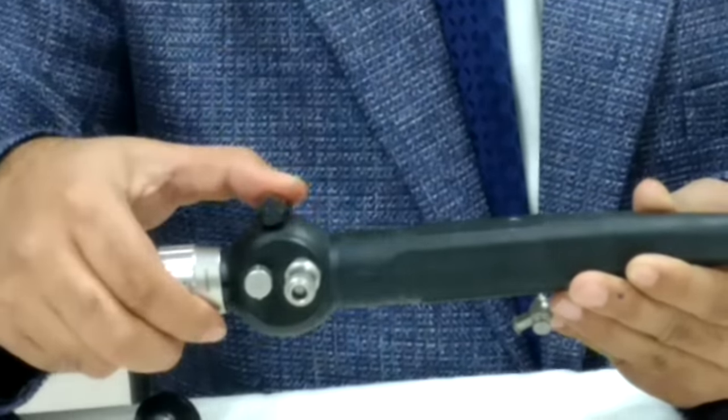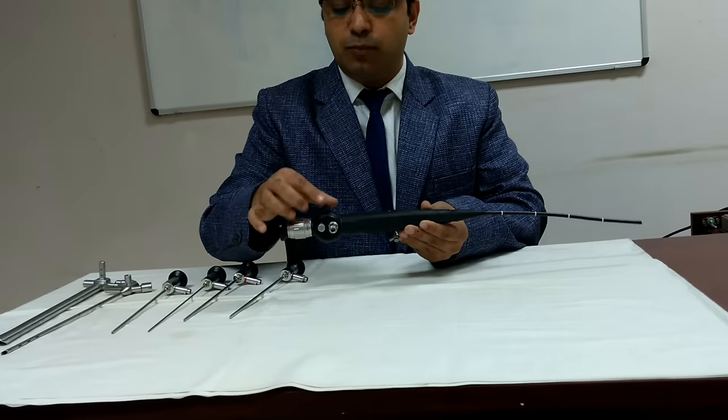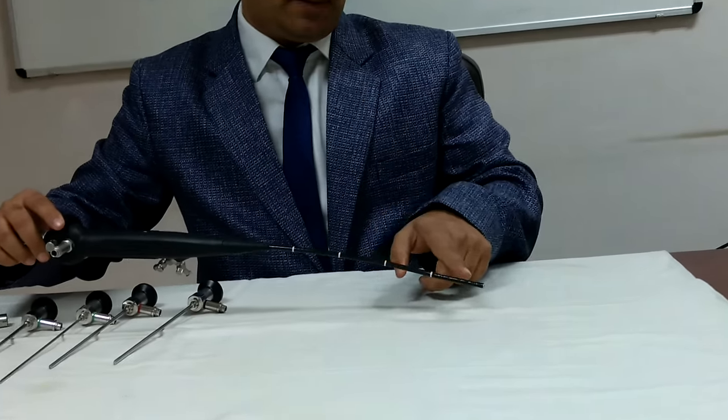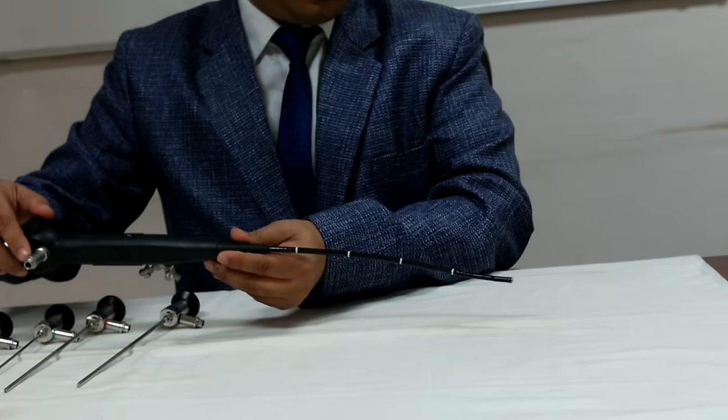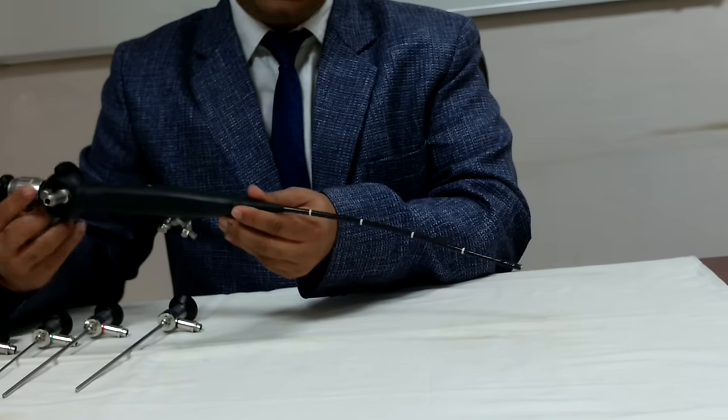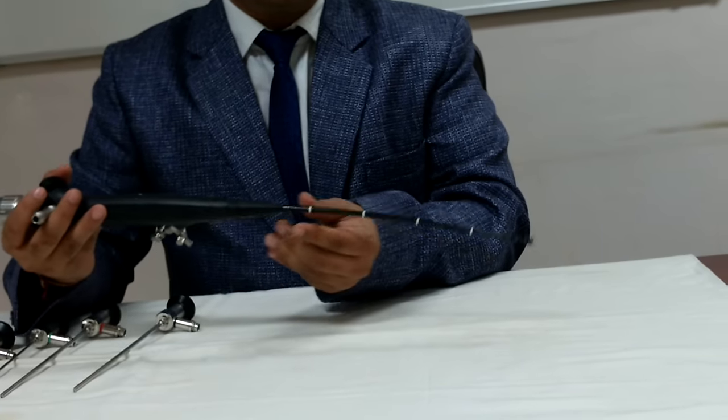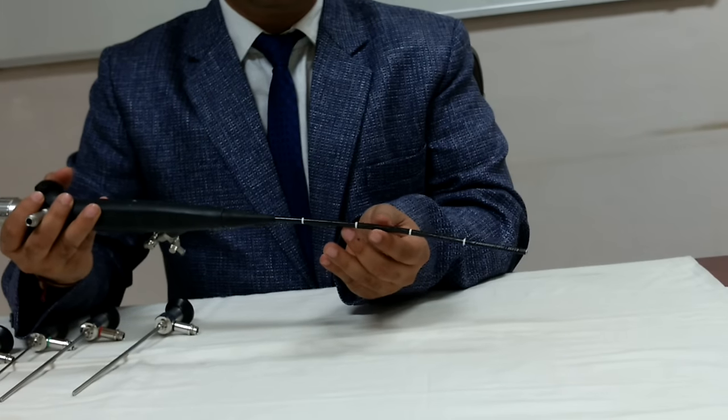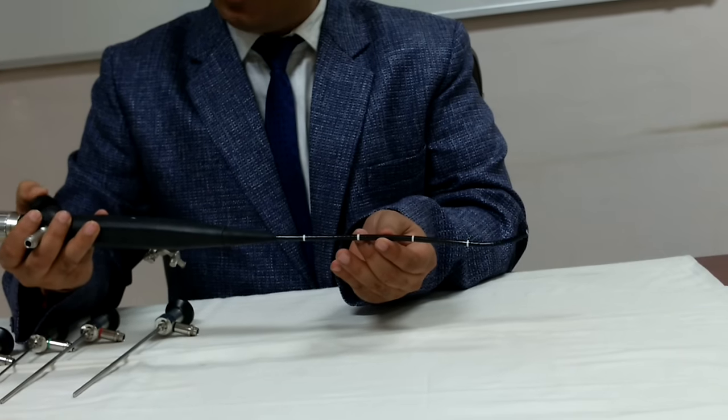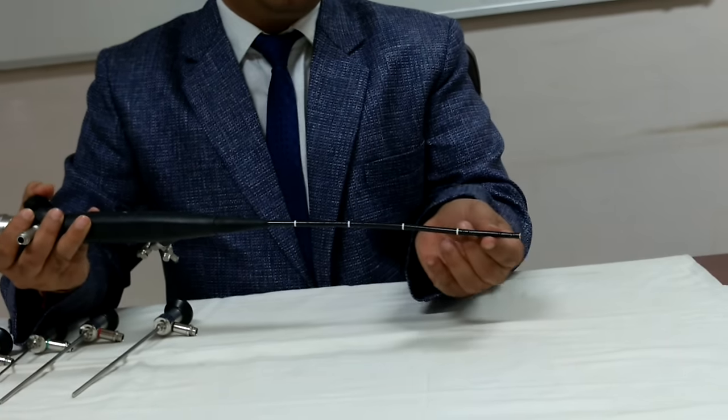You can see one knob here which I can move. Once I move the knob you can see what happens to the tip. So down, up. So once I introduce this scope in the nose or in the larynx, if I want to direct my scope I will use this knob to move the tip of the laryngoscope.